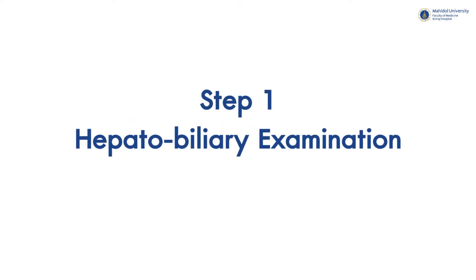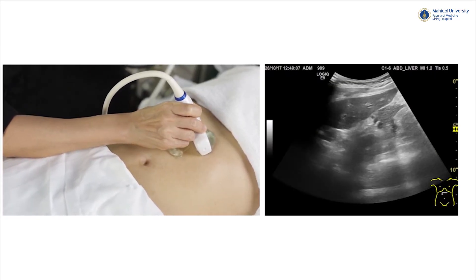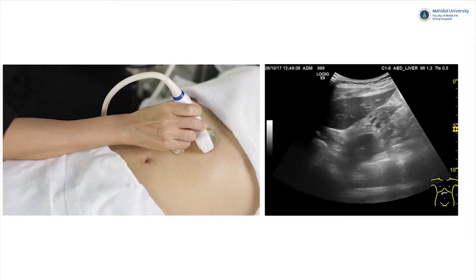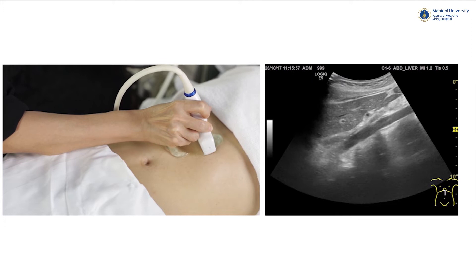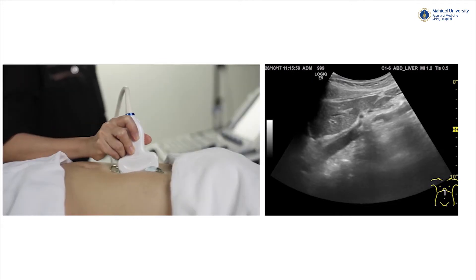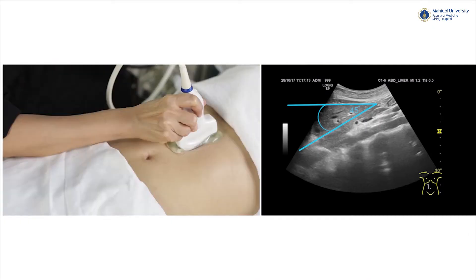During the steps of examination, we recommend that you examine each system respectively. Step 1: the hepatobiliary system exam. Start scanning from the left hepatic lobe first by placing the probe at the epigastric area in both transverse and longitudinal planes. A normal left lobe tends to be triangular in shape, making an acute angle of about 45 degrees.